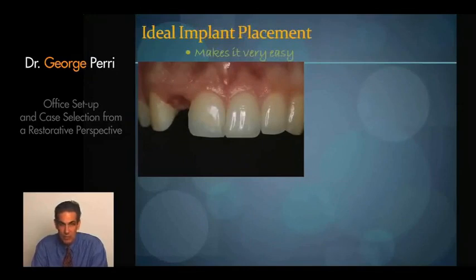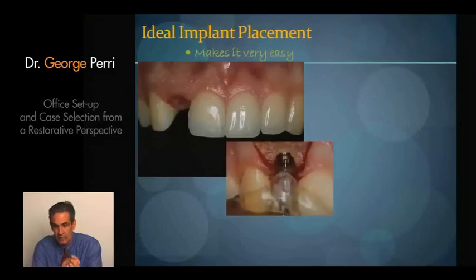In this example, basically we just numbed up the patient, ground the fragmented part of tooth number 7 below the tissue, and bonded the tooth number 7 in place, and honestly, 7 days later he looked good. The root was still subgingivally sitting there waiting for our restoration. 6 months later, Dr. Jovanovic and I went into the case. Dr. Jovanovic removed the root and, looking at the socket, placed an implant.